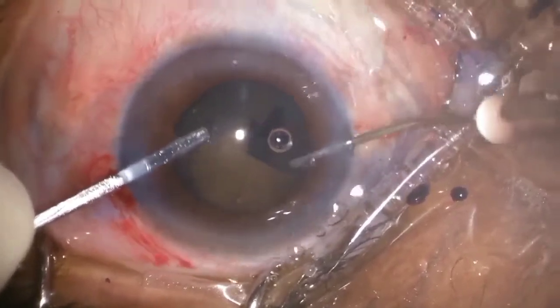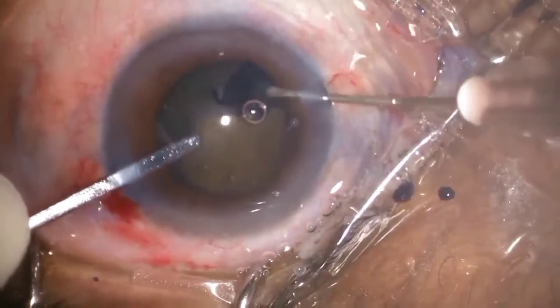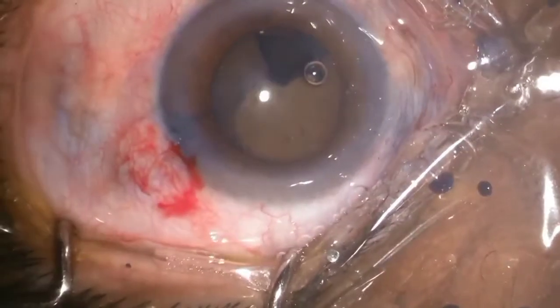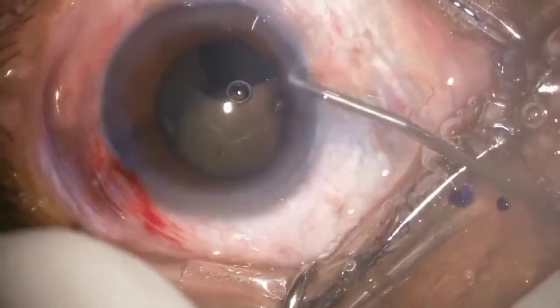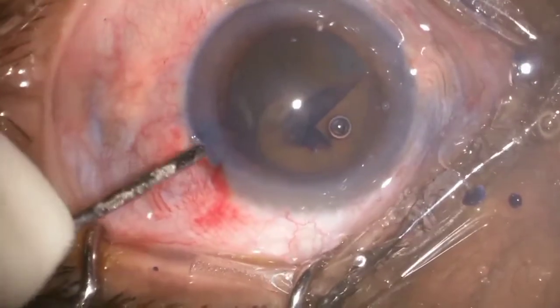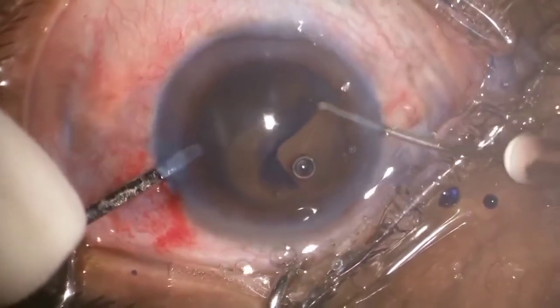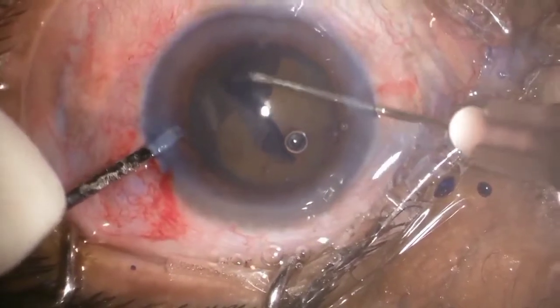I was doing it very slowly. I was not intending to do an extension of the rhexis, so at frequent intervals I was inserting visco in the anterior chamber to form the AC, and somehow slowly I was finishing the rhexis.